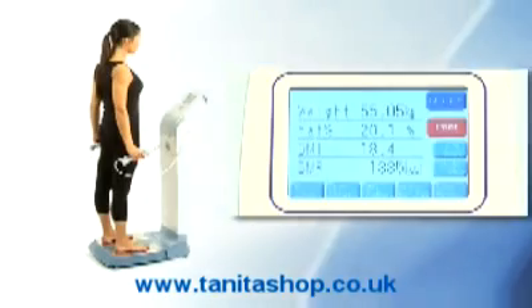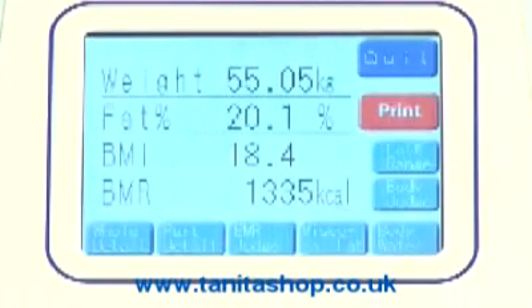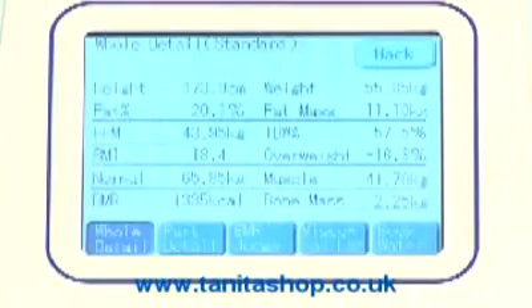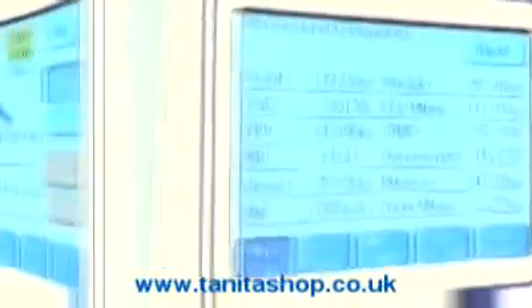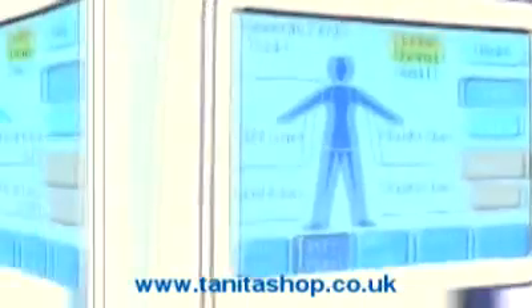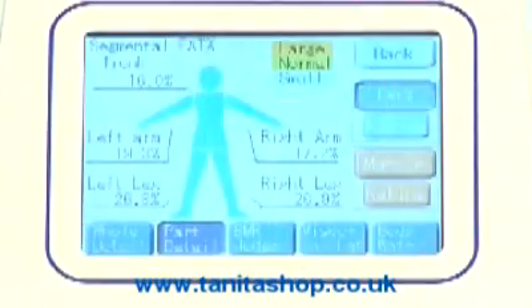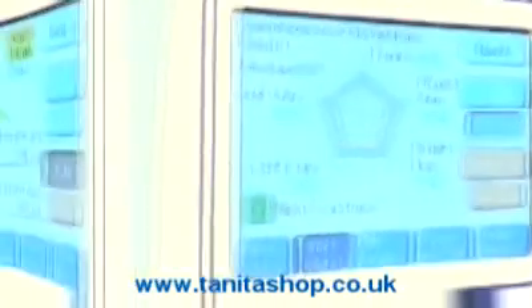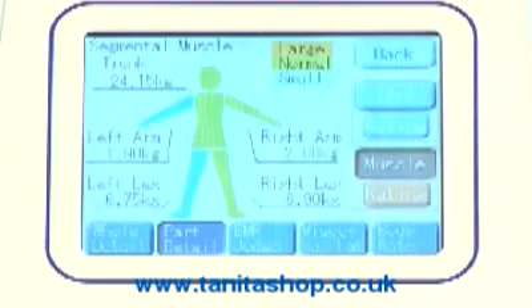Full body composition readings are shown on the touchscreen display, including a whole body summary with key body composition readings, segmental readings for each arm, leg and trunk area, segmental fat percentage for each segment, and a fat rating showing the individual's readings compared to average readings. Segmental muscle mass shows the weight of muscle in each segment.